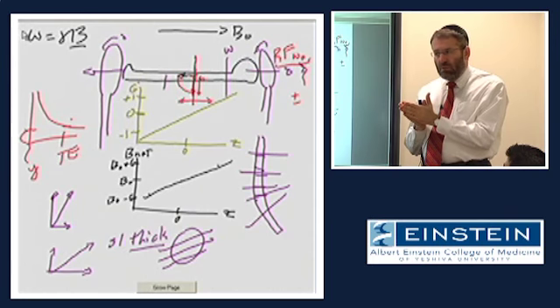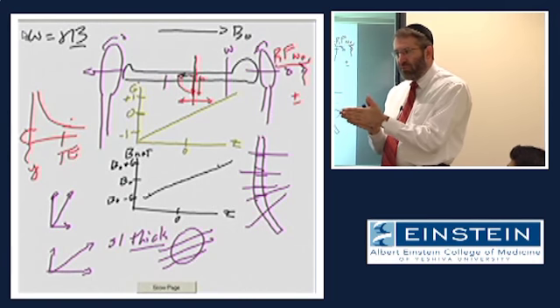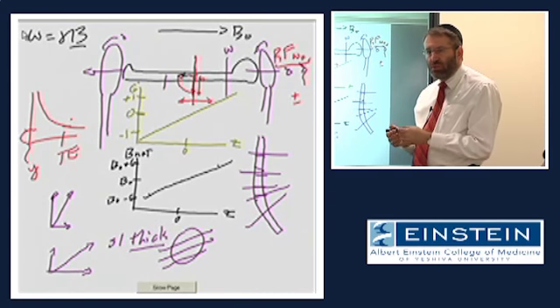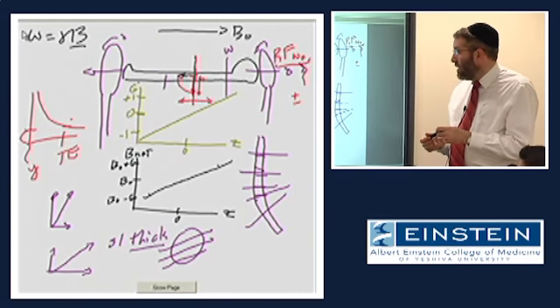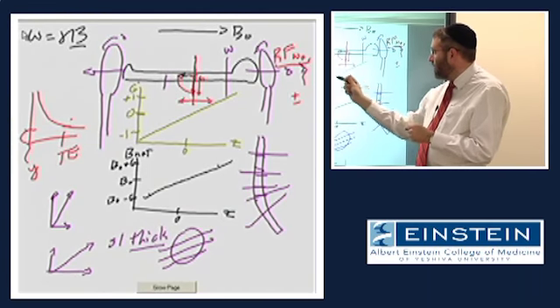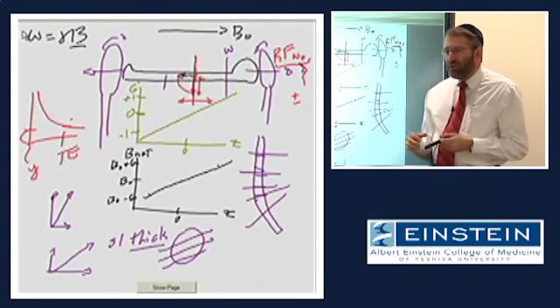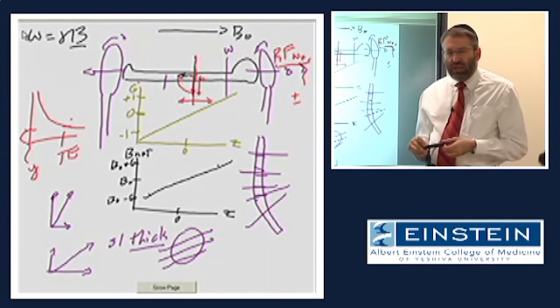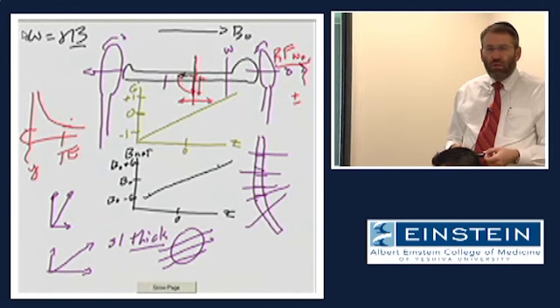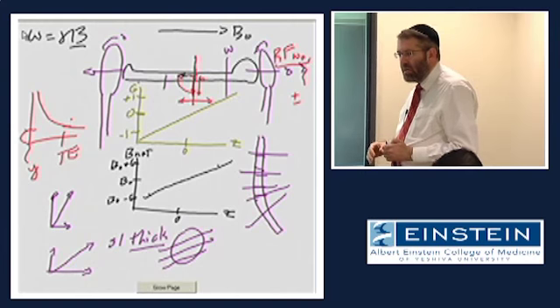Now, there are limitations on the extent to which we can super tune this RF. These are pretty high performance amplifiers, but there is a limit to how narrow a range of frequencies we can transmit. In fact, that limitation is such that under the example I've set up here, we might really not be able to select a very thin slice. So is there something else that we could do besides modify that range of frequencies that would help us to modulate the thickness of the slice?